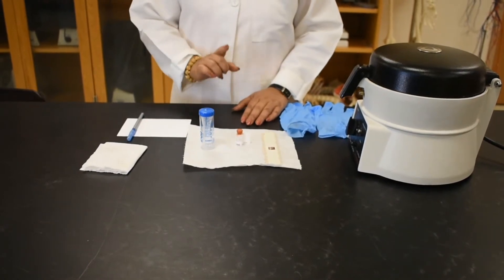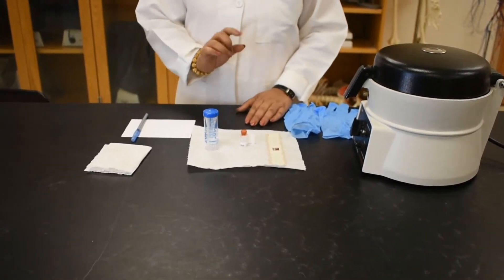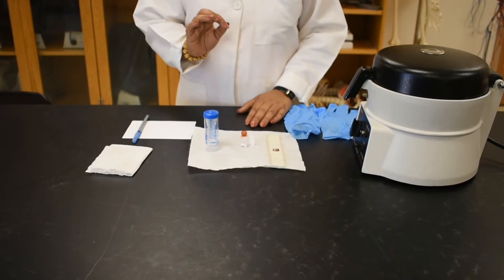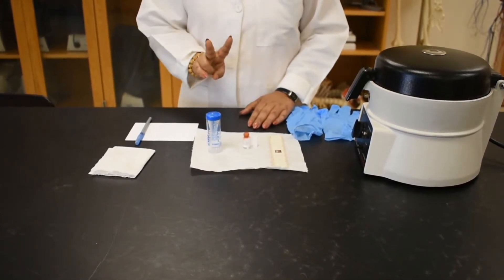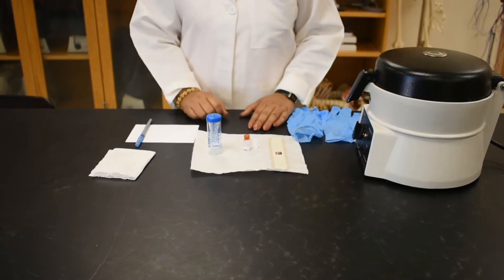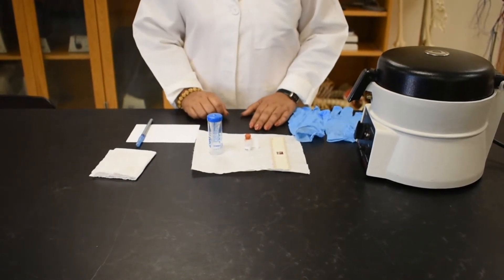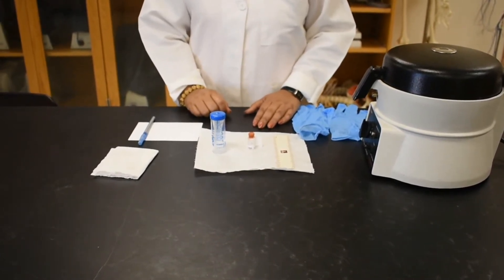Today I am going to show you how to prepare and read hematocrit value. As you know, our blood is formed by two components, blood cells and blood plasma. Hematocrit is the percent value of red blood cells in a whole blood sample.